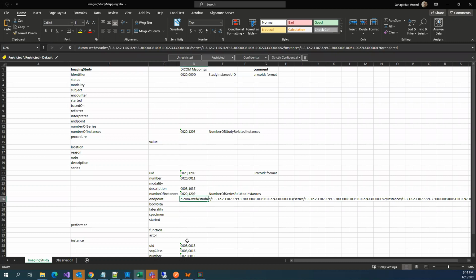Yeah. So in the Connectathon, basically, I think we will have various small groups, which we can divide into multiple teams. See, the writing templates, I think that is one big thing. Inside that template itself, there are various aspects which we need to take care of.